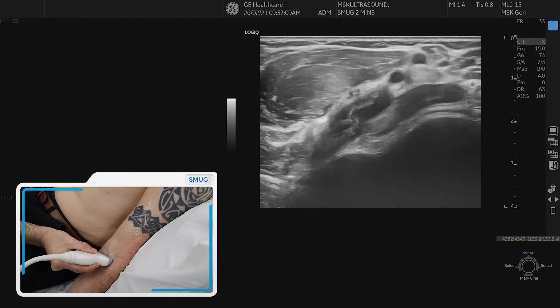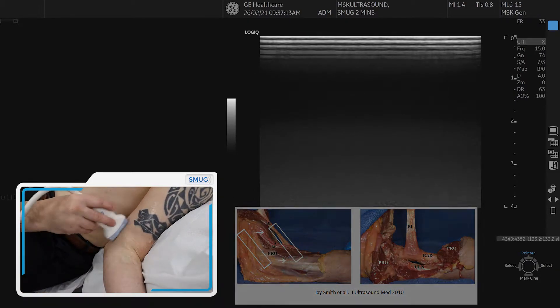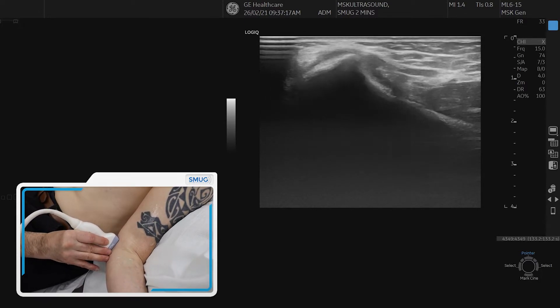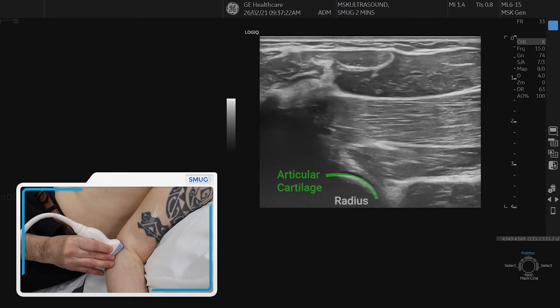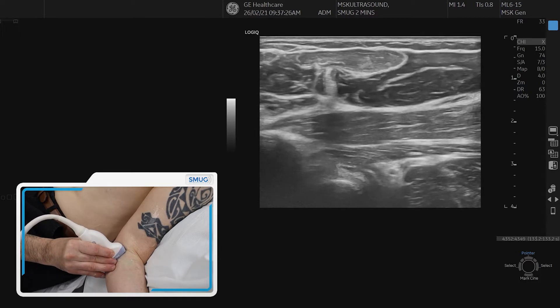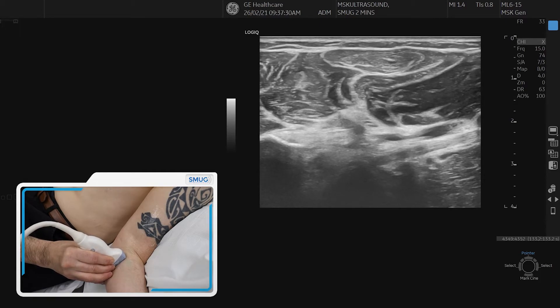So a good alternative is doing the medial approach. For that, we put the arm in 90 degrees flexion and line it up longitudinally with the medial condyle. Then we go straight forward into the forearm. Our eye should go to the radius, which is the cross-section bone with articular cartilage on top, at the bottom of the screen. We continue to go forwards until it starts to line up — there's the tendon.